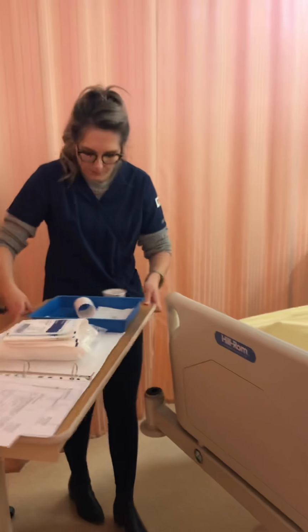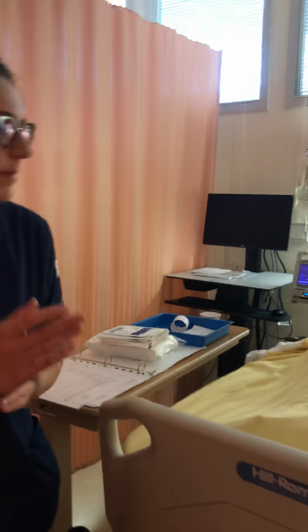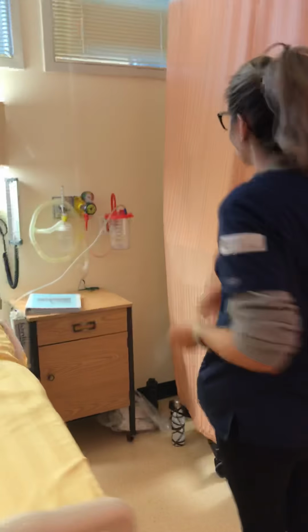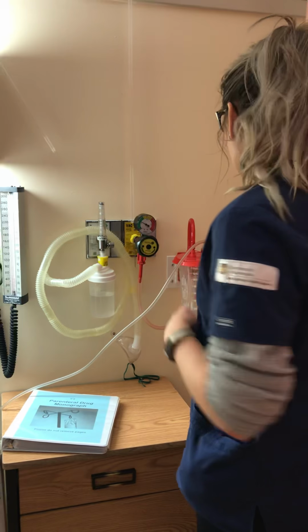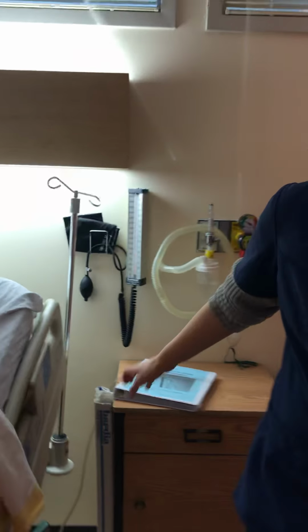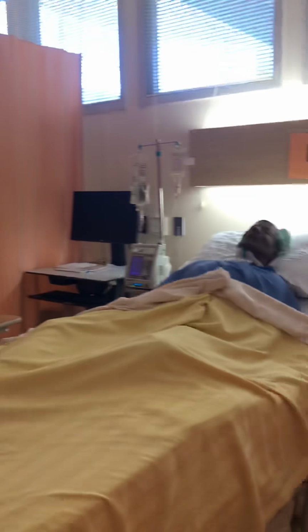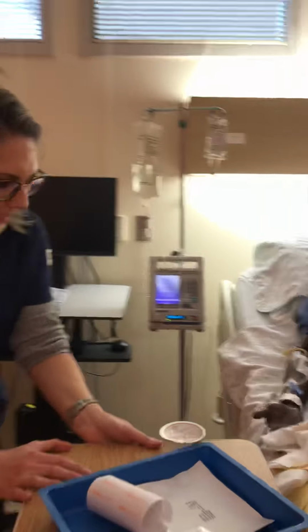I'm going to get this set up, and I'm going to start my safety checks. Okay, so first of all, I'm just going to go around to the suction here. My suction's already on. It's in the low suction, which the doctor has ordered. I'm going to make sure that all of these are closed, and I'm going to follow my line, ensuring there's no kinks, bends, or dependent loops in here. I want to make sure everything's draining properly.